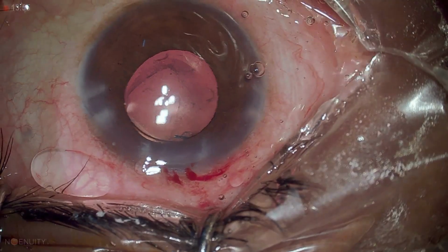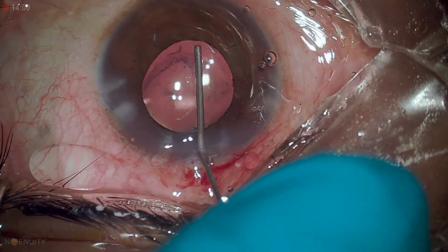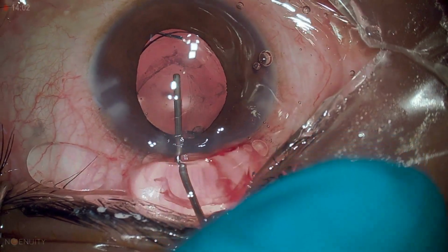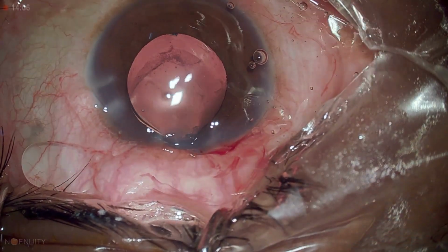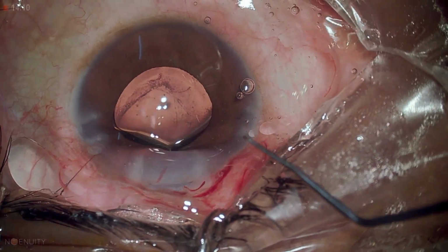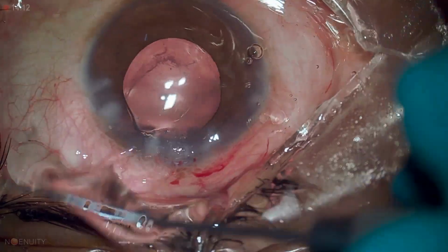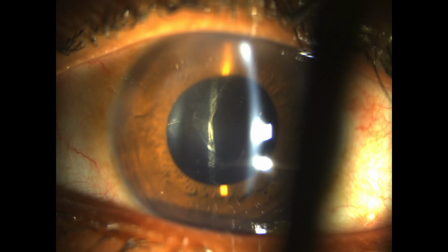What we learn out here is, unlike the vitreous, which, if allowed to, tries to engulf the nucleus and causes a nucleus drop, the silicone oil here, which is a high viscosity silicone oil, actually pushes the nucleus ahead. So it's never going to allow the nucleus to drop down.